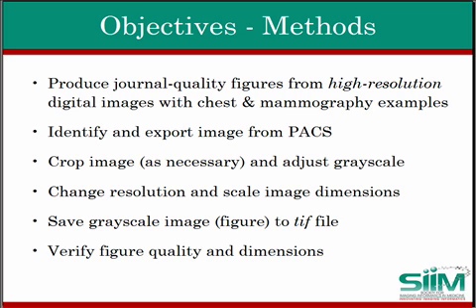The chest X-ray has typical acquisition dimensions of 35 by 43 centimeters and 100 to 200 micron pixel size. Digital mammography images are acquired with 18 by 24 or 24 by 30 centimeter field of view and have pixel sizes of 50 to 100 microns. Particularly for maintaining microcalcification visibility, increasing the DPI resolution beyond 300 DPI is recommended for close-up magnification views.